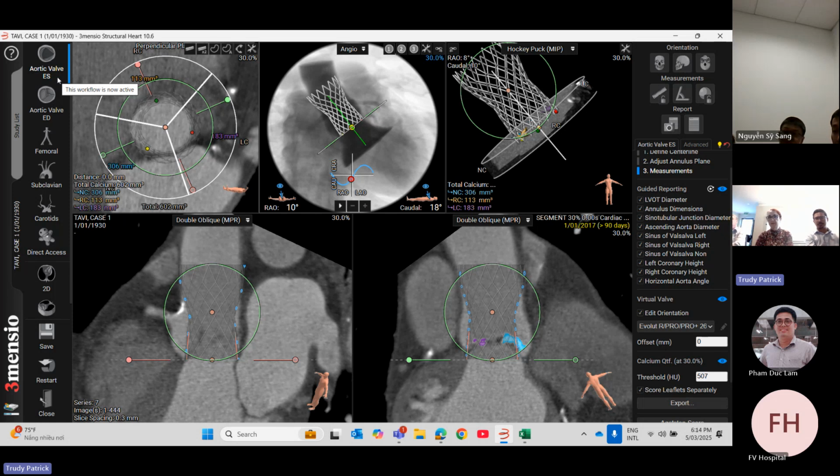That would fit into the criteria of treatment that you would have as your standard practice from us. But it would be difficult to land a valve if the patient's in rapid AF. There's criteria around that, and if you needed it, I could see if I could find a paper for you and send it to you about AF and valves.